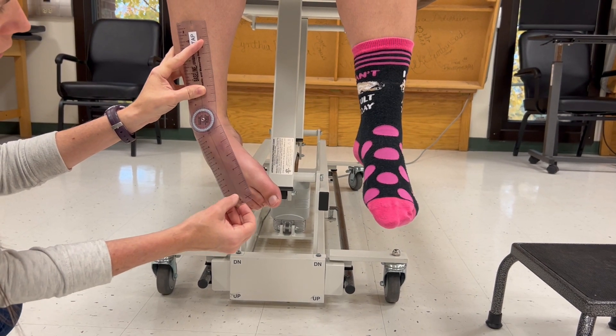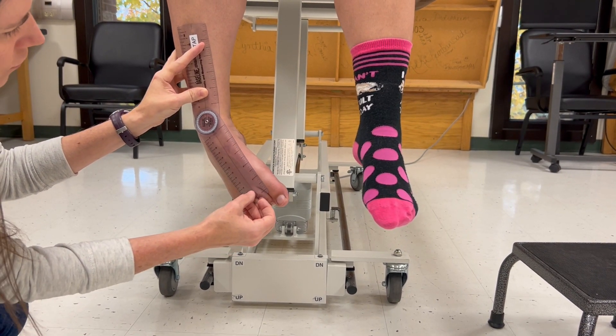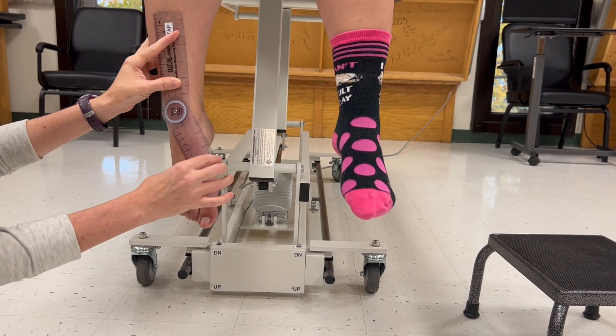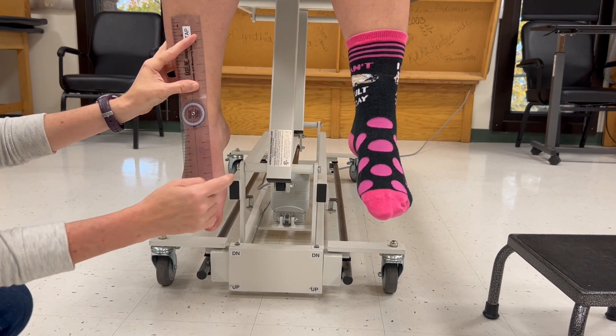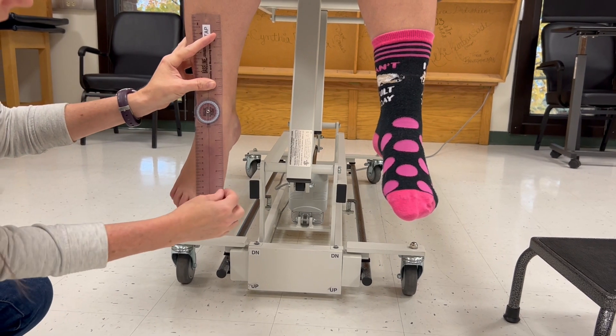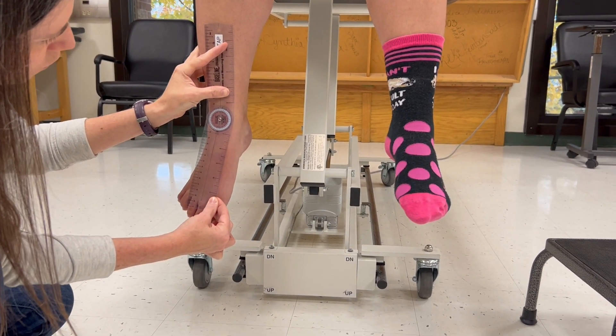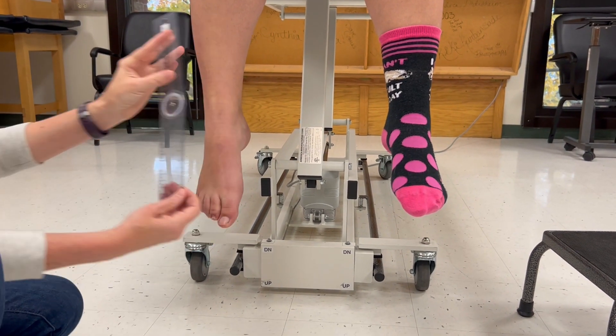She has about 30 degrees of inversion. Then I'm going to have her bring the foot out toward the right, and with the same setup she has about 12 degrees of eversion.